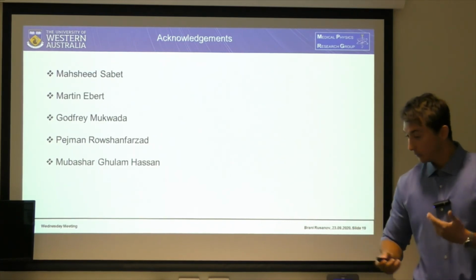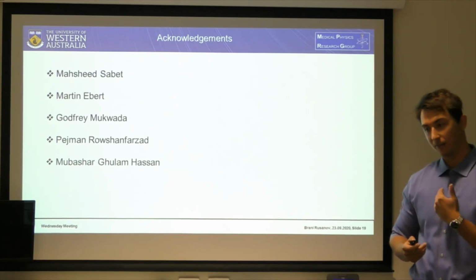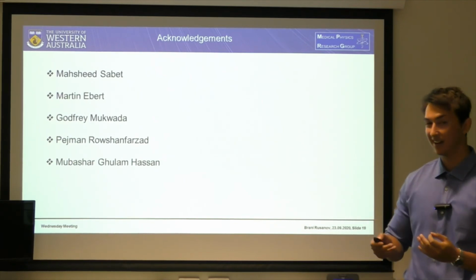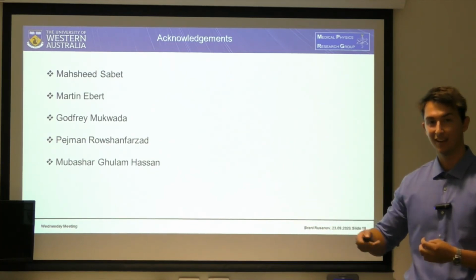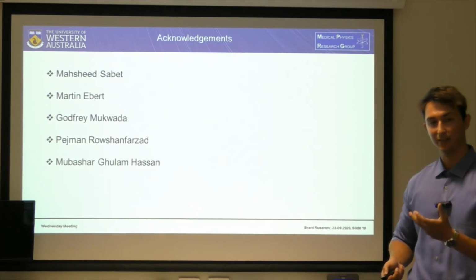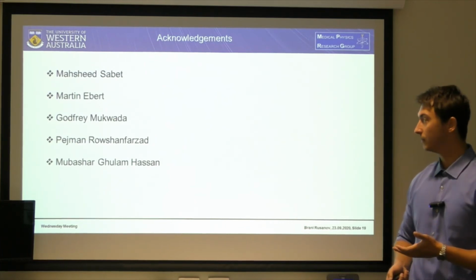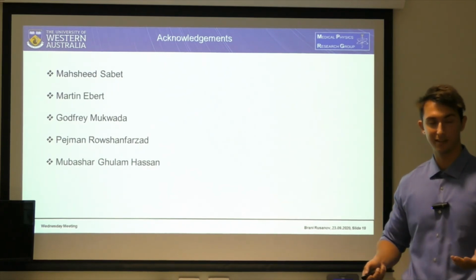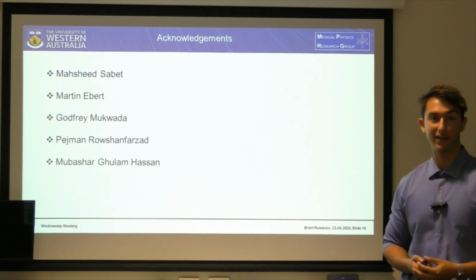With the machine learning method, I'm not sure if there's any of these flat panel detector non-uniformities present in any of my data, so I don't know. And it'd be very hard to actually teach a model, because if you use it on a different flat panel detector, you don't know on that day or 2 weeks later, is it going to perform the same? It's not predictable, it's not consistent, and so therefore, I guess that is a limitation. But in general, scatter is by far the most deleterious feature for cone beam reconstructions, and it manages to handle it pretty well with just 4 phantoms, which I thought was pretty good.